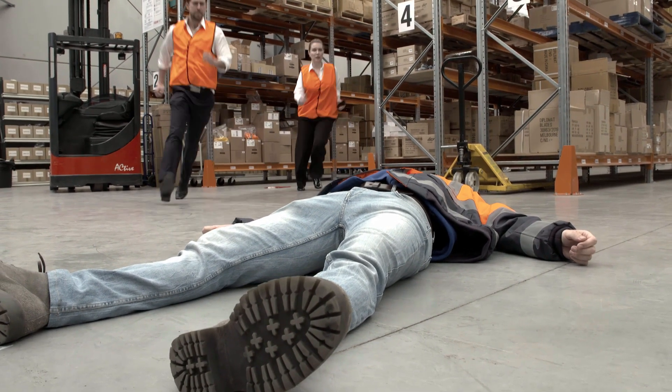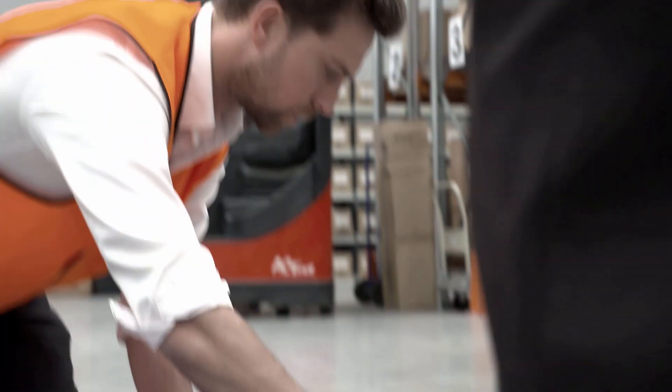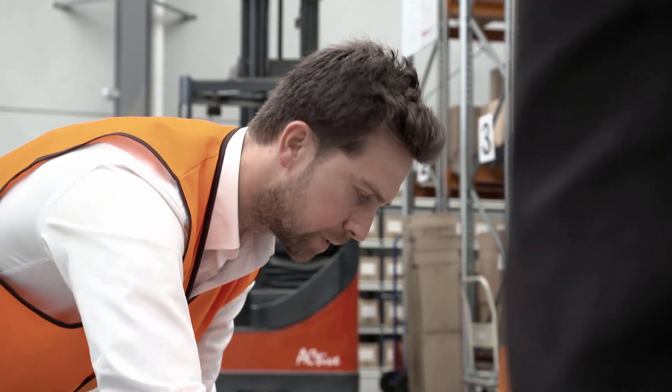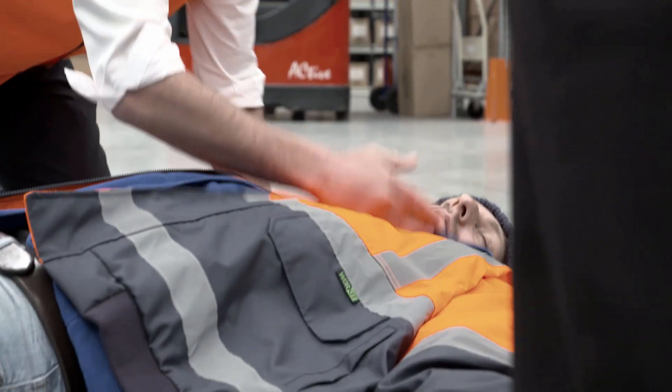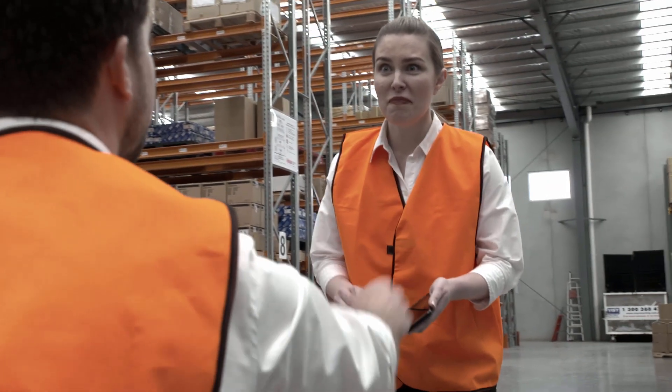Check the patient's response to talk and touch. Touch or tap the patient's cheek and ask if they're okay. If there is no response, call Triple O Ambulance. Call Triple O and get the defib.